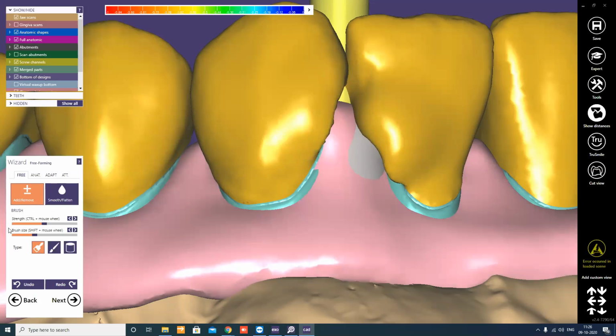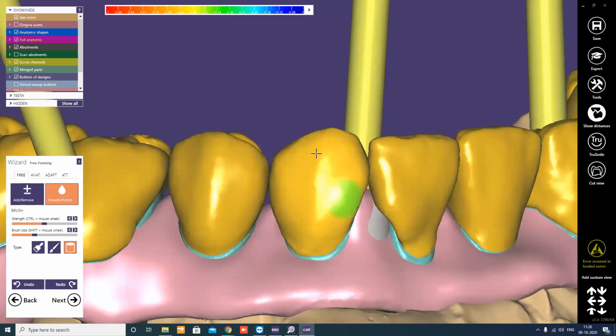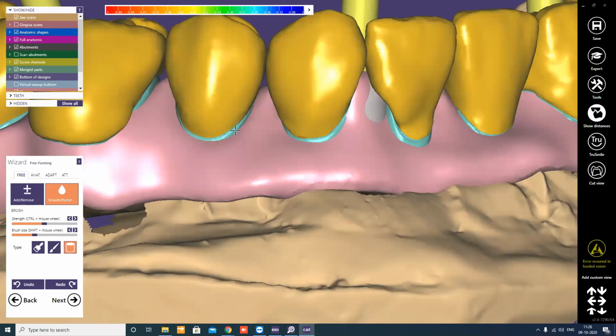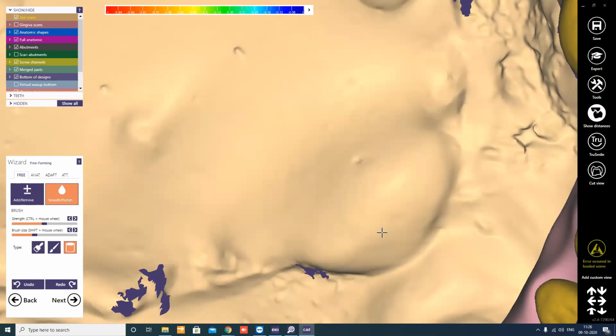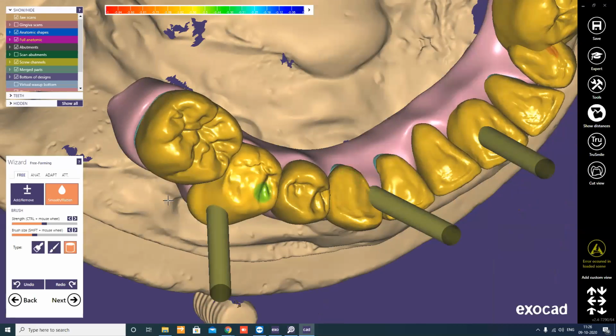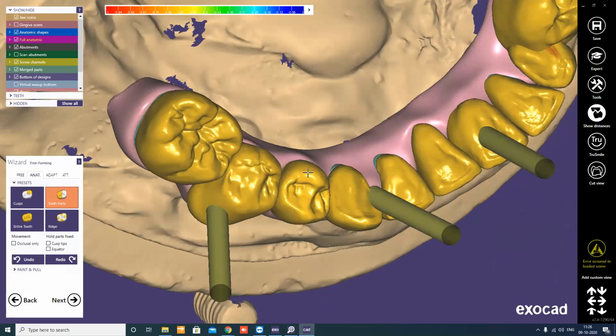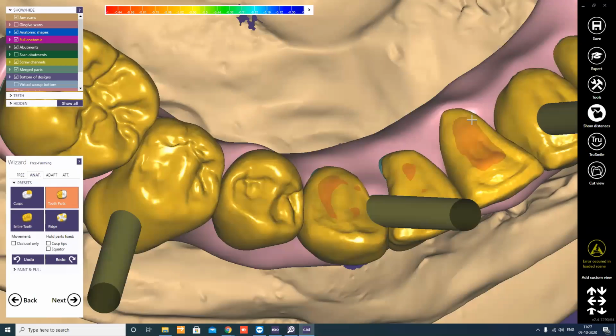Now this is a bit dicey. Just smoothen it. You can just pull in because it is too bulgy and cause some tongue thrusting.